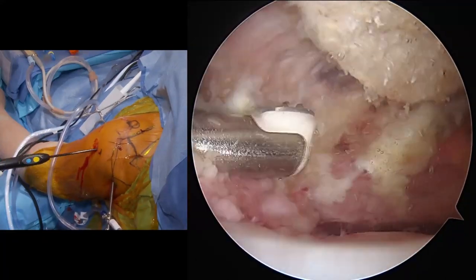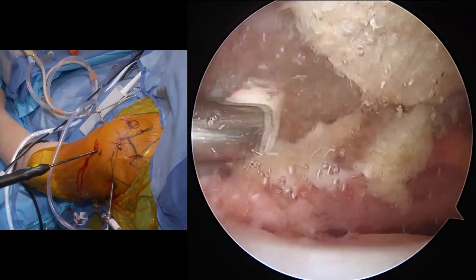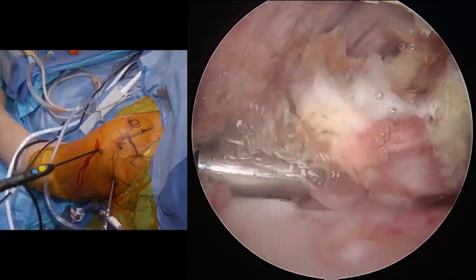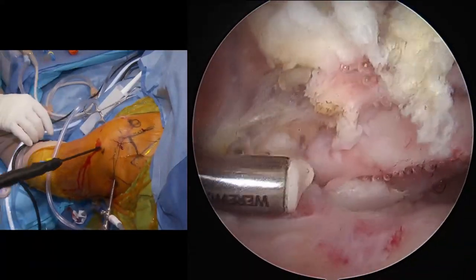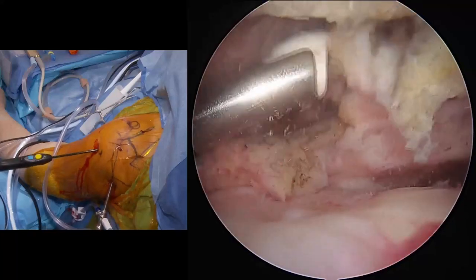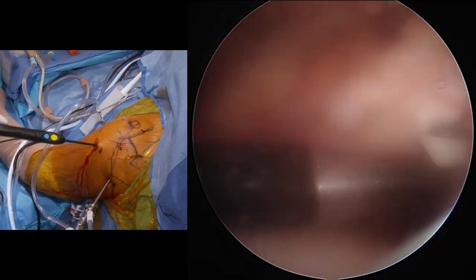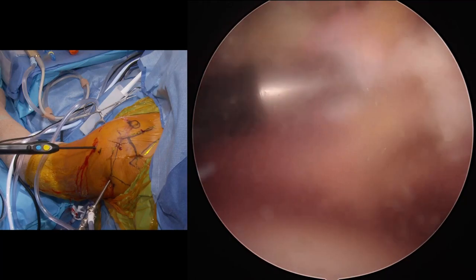I don't know where all that's coming from, but the tear is on the anterior lateral corner, which can be a little tricky to get to sometimes because of the thickening of the coracoacromial ligament and the edge of the acromion. So it's sometimes quite helpful just to move this out of the way, like we always did with traditional open surgery. It's not necessary for a good result, and it can get in your way. So it's nice to prepare this and get this cleaned up.